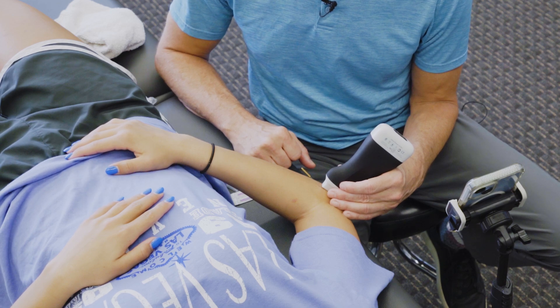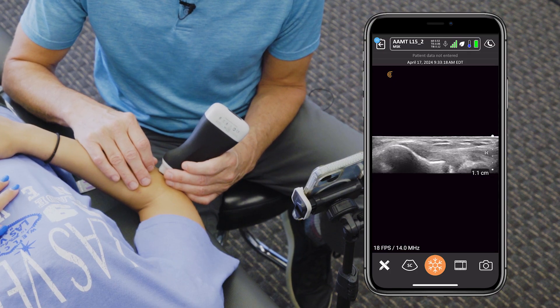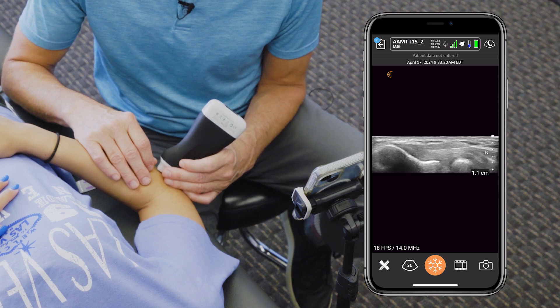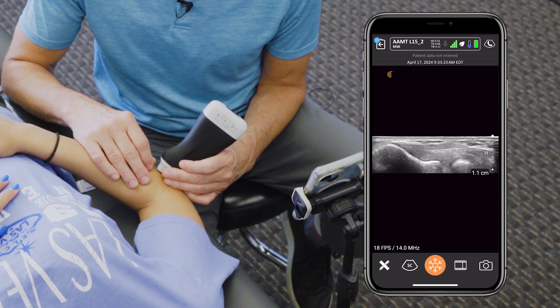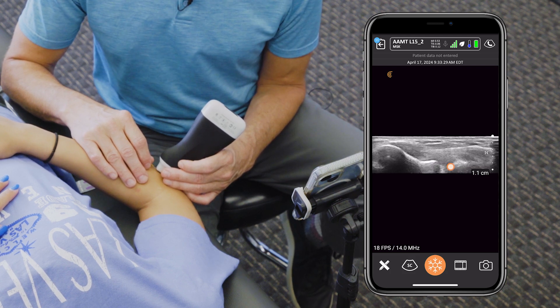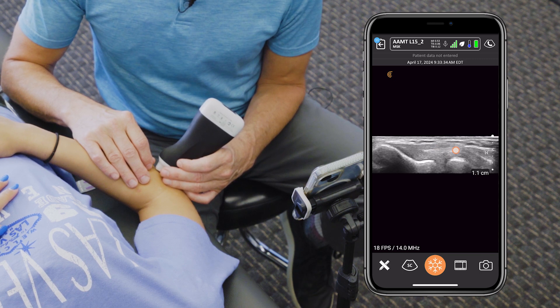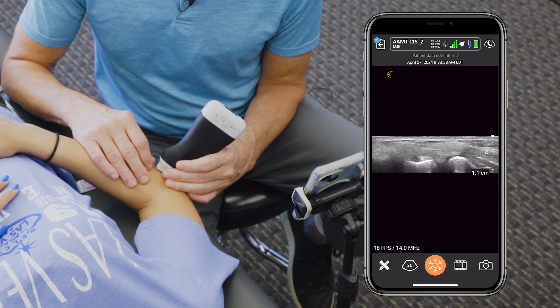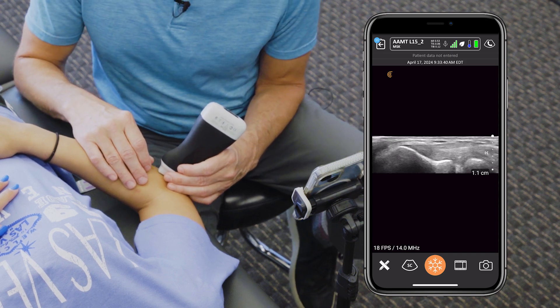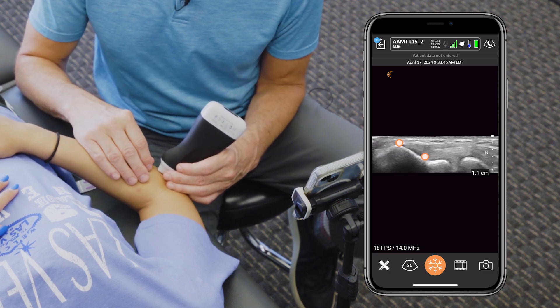We're going to place the probe in long axis view and get the view of the humeral radial joint. We'll look at some important structures: the lateral epicondyle, the joint, and then the radial head. Spanning that joint is the radial collateral ligament, which runs about halfway up the slope of the lateral epicondyle, and just superficial to that we have the common extensor origin.